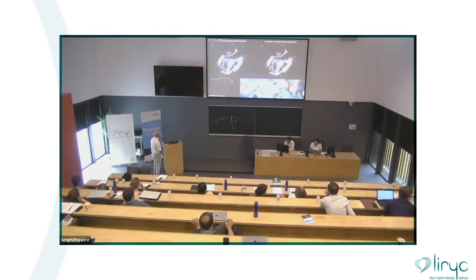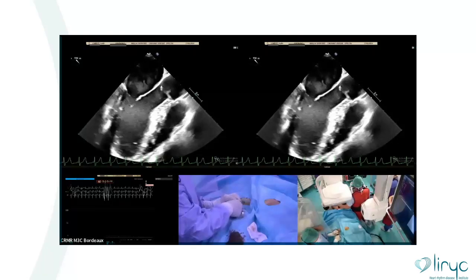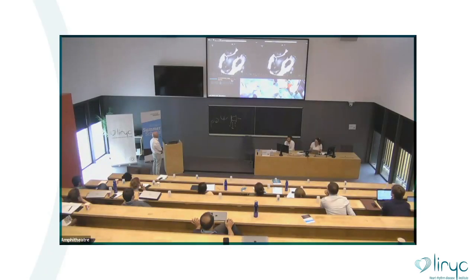I have a question for Dr. Pan. Mark has a question for you. In order to know the orientation of your bend, do you use sometimes the outside markers from your catheter? So we know that there is a flare over there and a written message, the size of the catheter and things like that. Is the relationship good enough? If there is no torque, knowing where the outside hub is, is that good enough to tell you how the curve of your catheter is going to be?